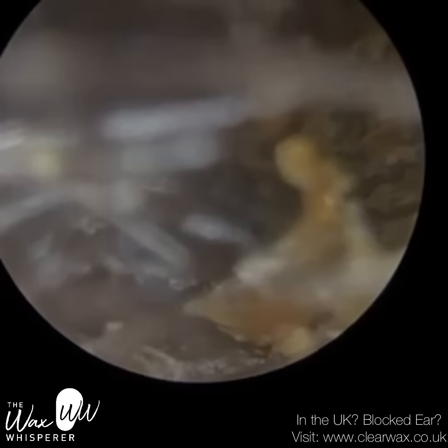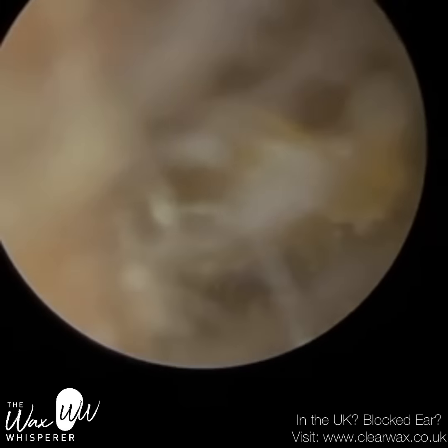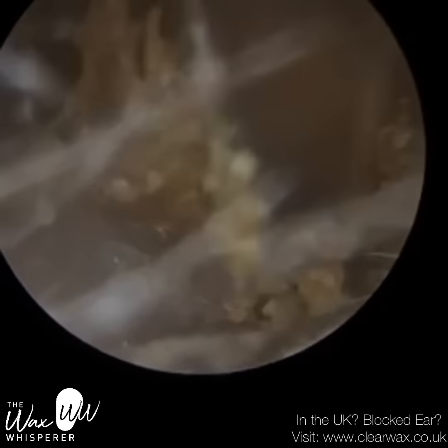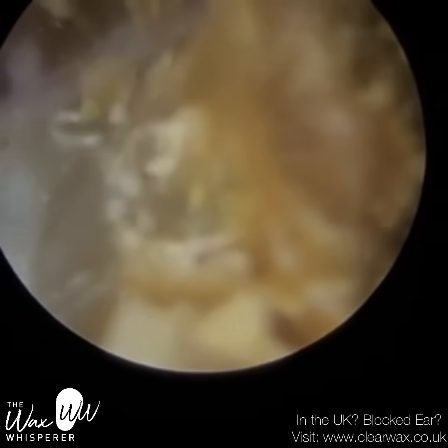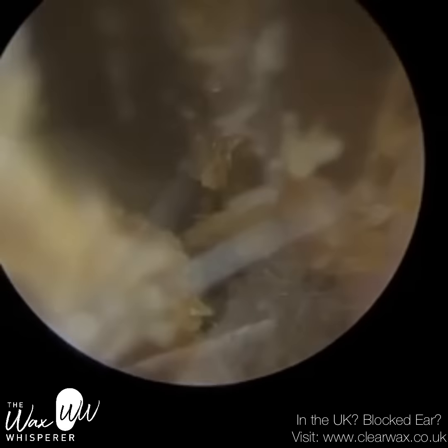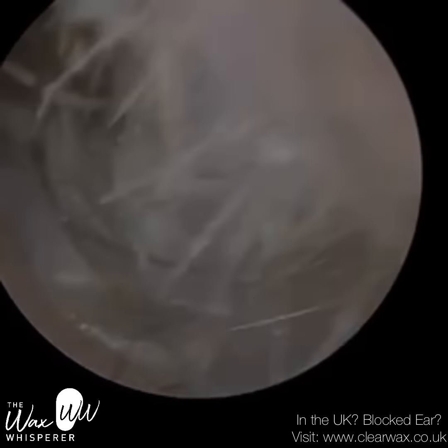And I think it was at this stage that I got an appreciation of just how significant this widening and this dip is in the patient's ear canal. It's right near the entrance. So I'm going back in with the forceps now that I've elevated it and retracted the skin plug and wax plug away from the canal wall. And I've now got a good grip. This plug has been detached from the canal wall somewhat, so it's easier to extract now. I'm holding the forceps more horizontally. As opposed to the top jaw being at 12 o'clock and the bottom jaw at 6 o'clock, the top jaw is now at 9 o'clock and the bottom jaw at 3 o'clock, which gives me a bit of purchase.